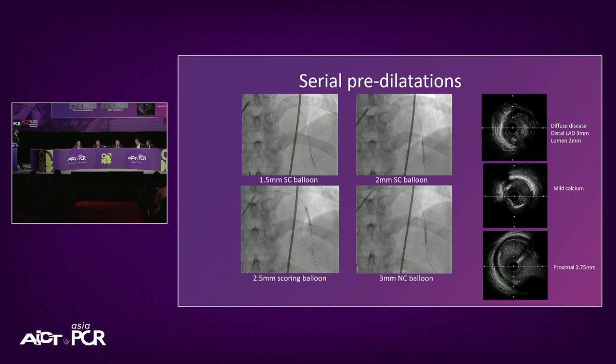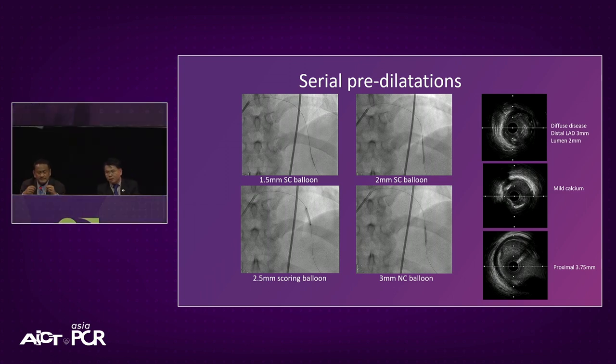So if you are doing this without IVUS now, the balloon expanded pretty well. Is that the same sizing or how have you done it differently? Yeah, after you dilate, then you will have to use nitroglycerin and see what is the vessel size and you have to estimate. I would try to use DCB even in the mid-segment as much as possible. So we try to prepare the vessel as well as you can. I would tend to use a scoring balloon or even a cutting balloon. Ensure that it's quite full and then you see the results. Even if there's a dissection, as long as the flow is good, that's good enough to do DCB. But if you have a dissection, you tend to wait a while to ensure that there's no risk of abrupt closure. If you wait about 5 minutes or so, the flow is still very good, and the dissection is not getting worse, then you can use a DCB.